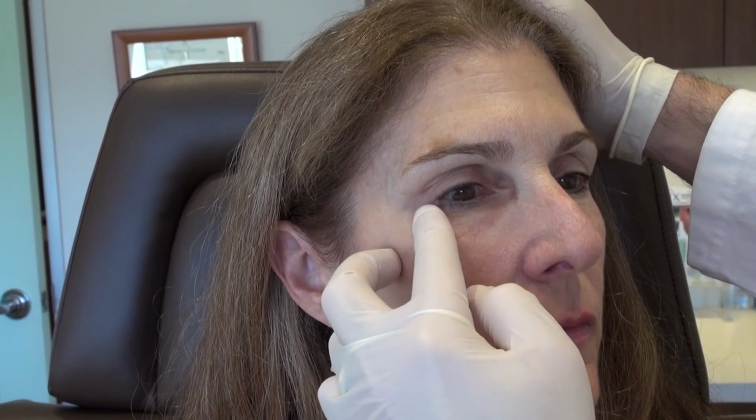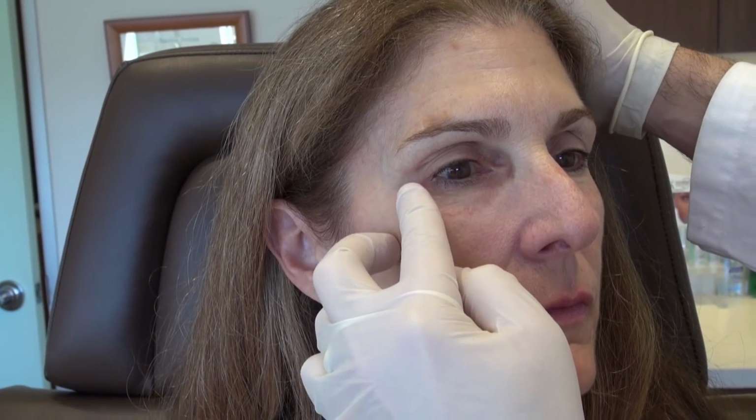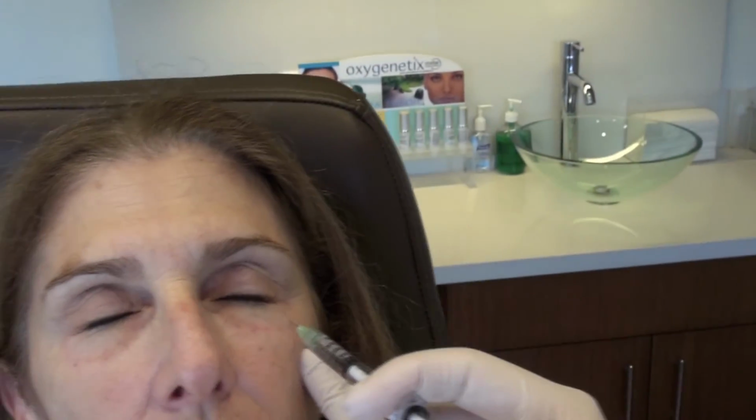So you have to be a little bit more conservative and inject maybe not right on top of the bone, but a little bit inferior to the bone, like in this area, and then push the filler up to make sure that there's a nice smooth contour. And then what I want to do is go a little bit over here. Again, very small needle, very light, slow injections, always moving the needle.